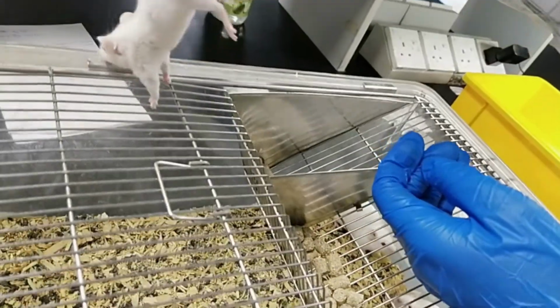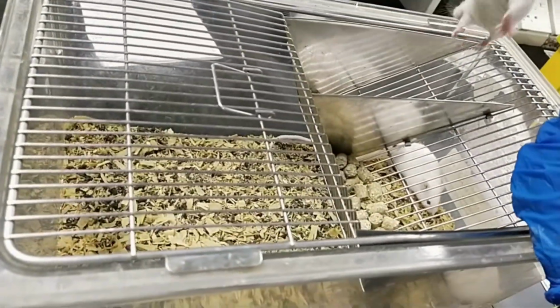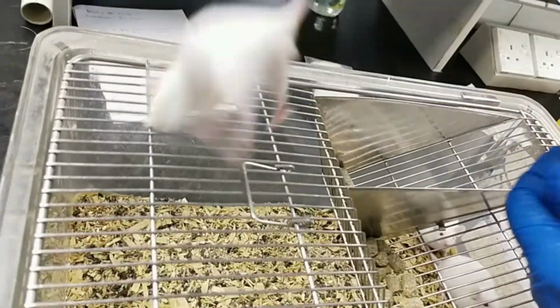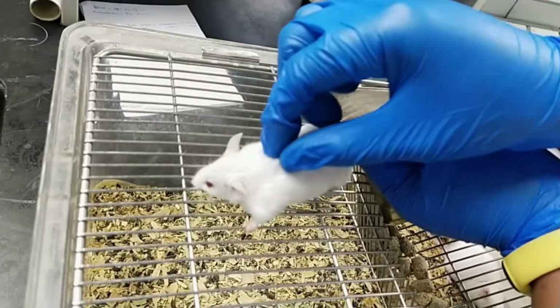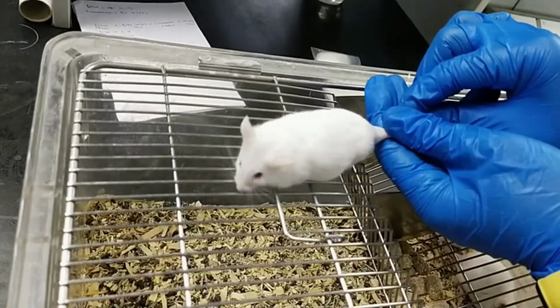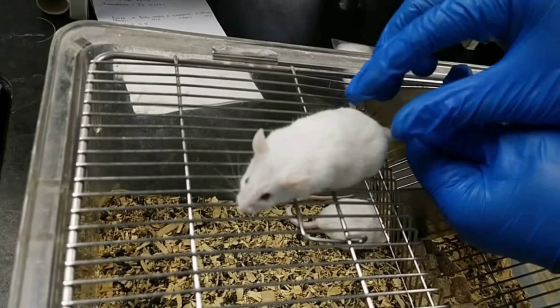So now we're going to proceed with the subcutaneous injection. So for the subcutaneous injection, we need to inject at the loose skin. Normally we're going to inject at this area, the skin area, because this skin area is quite loose, easier for us to grab and easier for the needle to pierce through the skin. So as usual, we need to grab the animal.